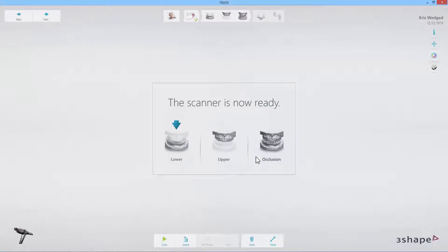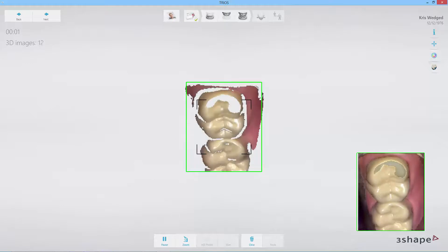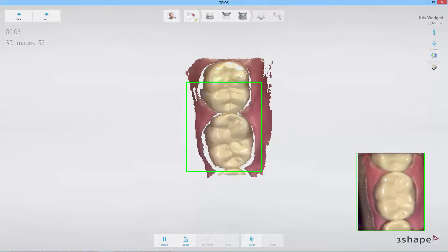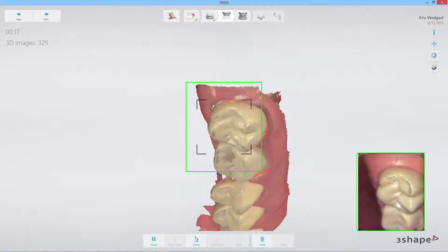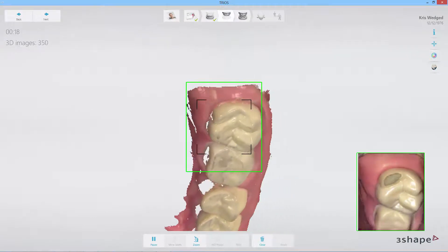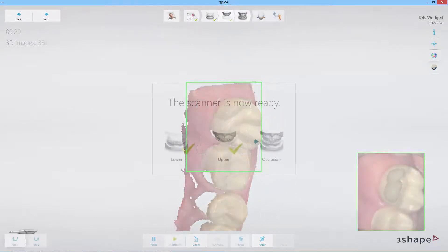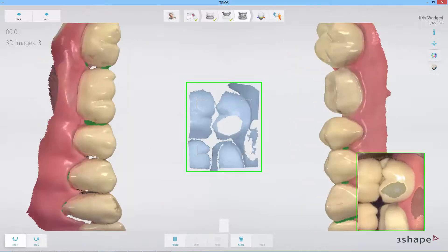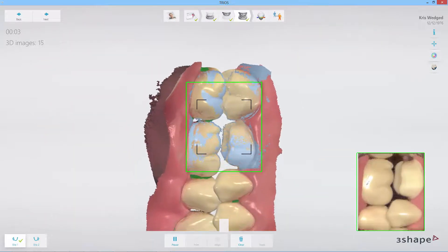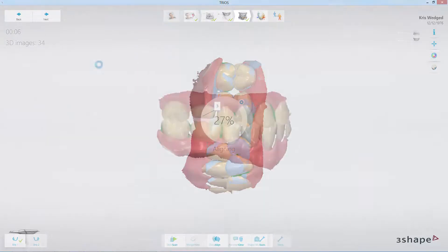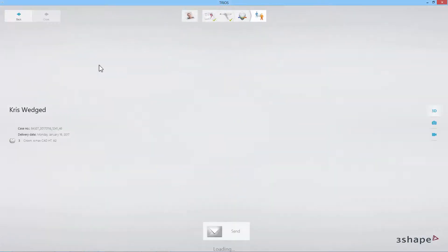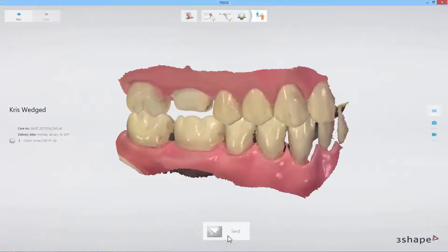Scan the patient as usual. Next, send the case to an external lab or mill in-house.